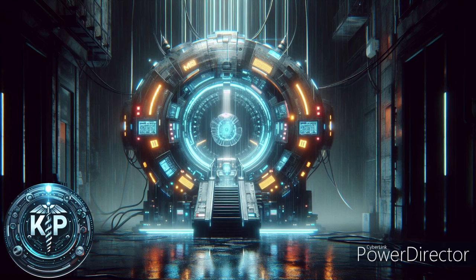Power outages. Symptoms: glitches, shutdowns, or boot up issues after storms. Solution: reset breakers for the MRI section in the building. Fully reset the system if needed. Prevention: weather-related problems are unpredictable. No specific preventive measures.